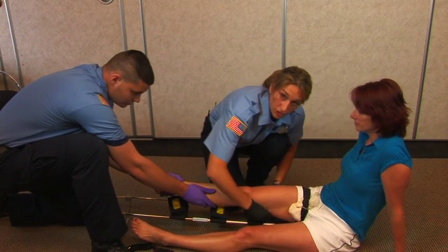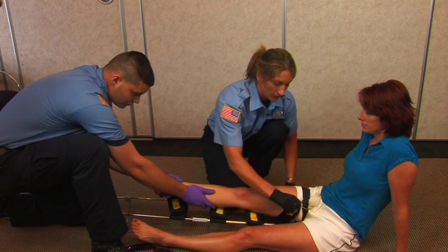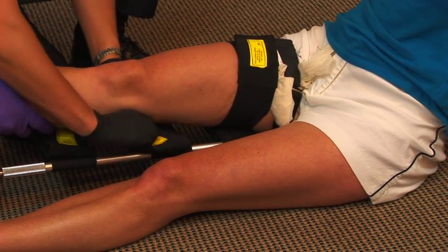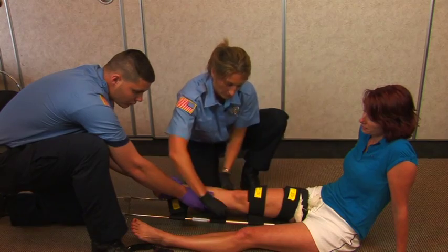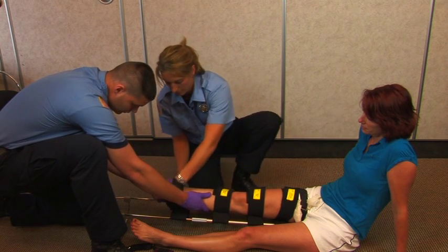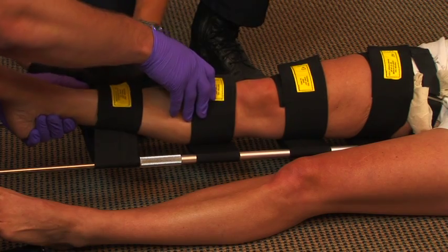There are four straps that need to be applied. The first one will go above where the suspected break is. The second one will go below where the break is but above the knee. The third one will go below the knee. The last one will go above the ankle.